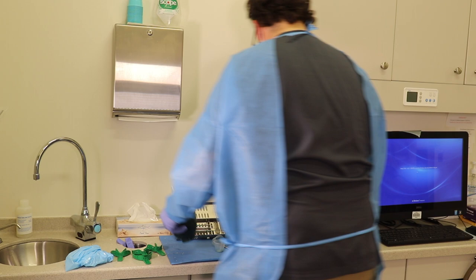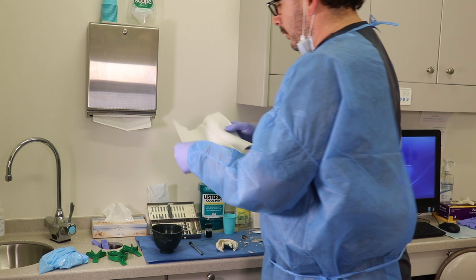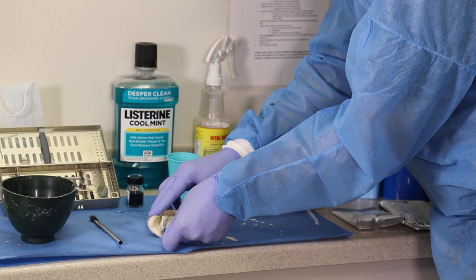For the lower impression, we need to fabricate the tongue space. We need to fill up this tongue space. There's so many ways to do this. A very easy way to do this, I'll show you. You will grab a paper towel. This paper towel, you wet it. And then you fold it until you can pretty much put it right here.